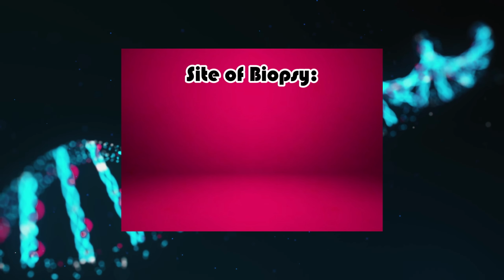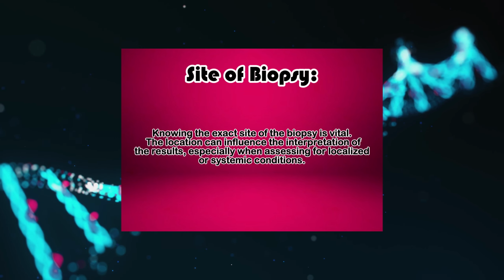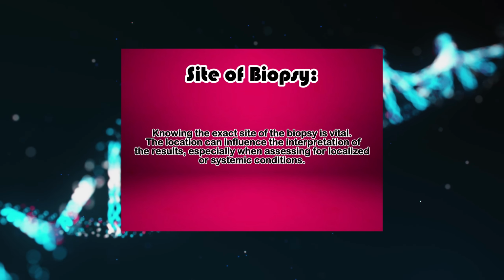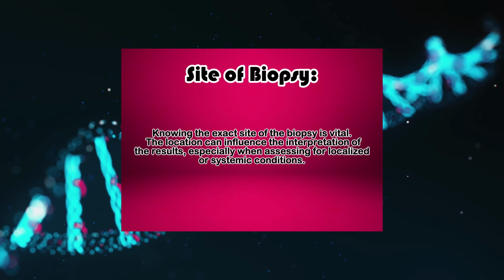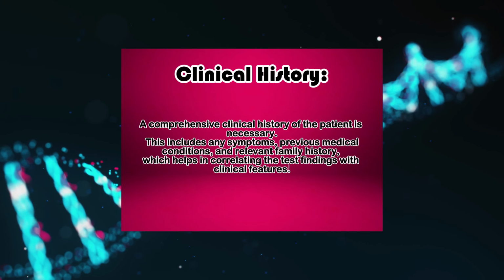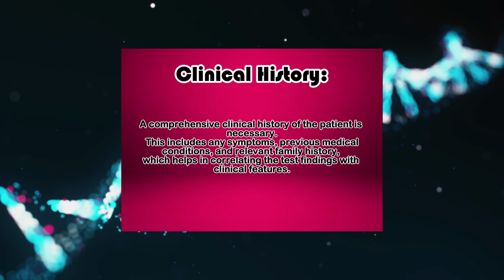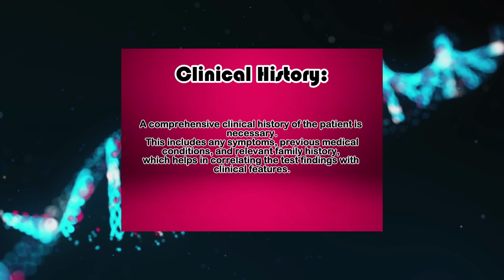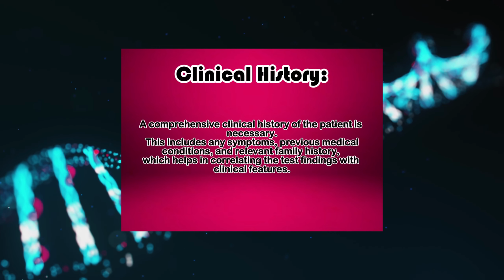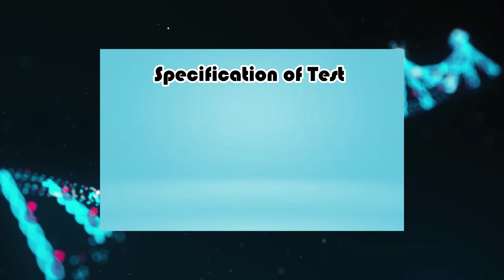Site of biopsy. Knowing the exact site of the biopsy is vital. The location can influence the interpretation of the results, especially when assessing for localized or systemic conditions. Clinical history. A comprehensive clinical history of the patient is necessary. This includes any symptoms, previous medical conditions, and relevant family history, which helps in correlating the test findings with clinical features.